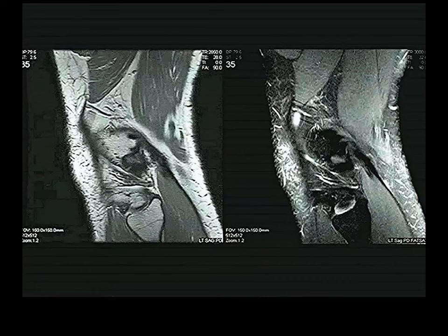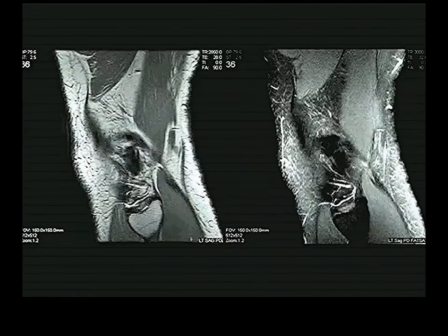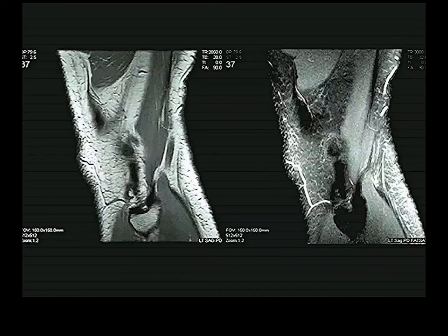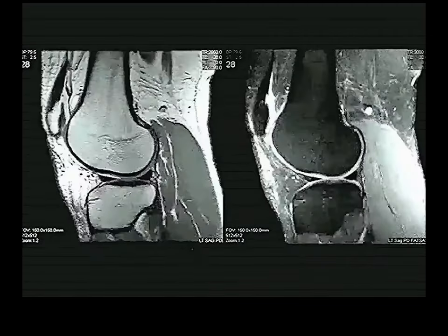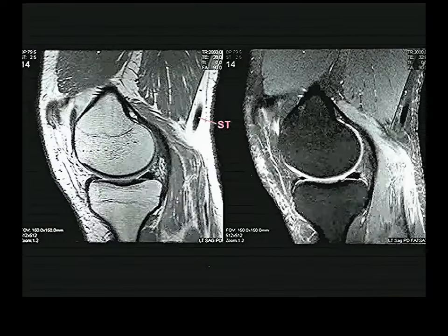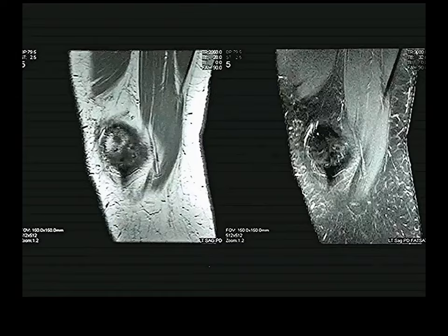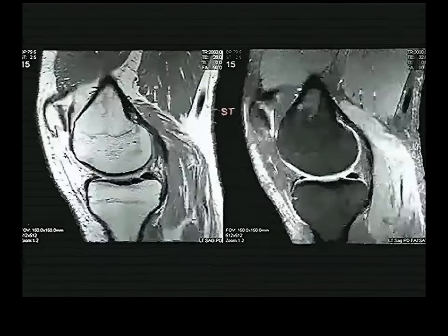The MCL and LCL are in the coronal plane, so sagittal sections are not ideal for viewing them. The medial collateral ligament is attached to the medial meniscus; the lateral collateral ligament is very far removed from the lateral meniscus. You need coronal plane MRIs to see the collateral ligaments well.